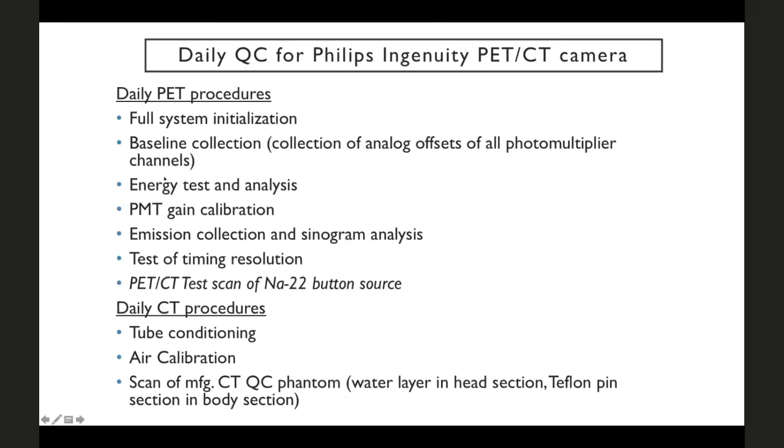We have PET QC and we have CT QC. We actually learned that both of those could pass, but you couldn't actually do PET/CT scanning because they're two separate systems. So we added in a scan which would guarantee, by doing a PET/CT scan, that the systems were communicating with each other and that they both agreed on where events are positioned.